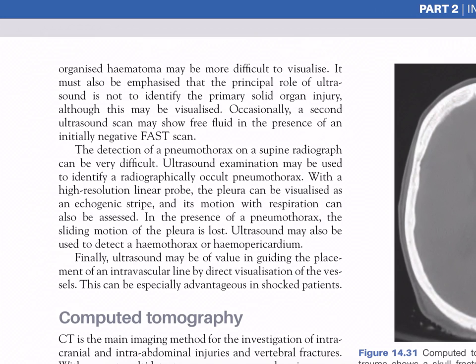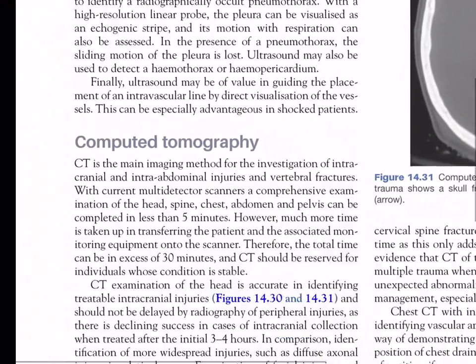Ultrasound may also be used to detect a hemothorax or hemopericardium. Finally, ultrasound may be of value in guiding the placement of an intravascular line by direct visualization of the vessels. This can be especially advantageous in shock patients.